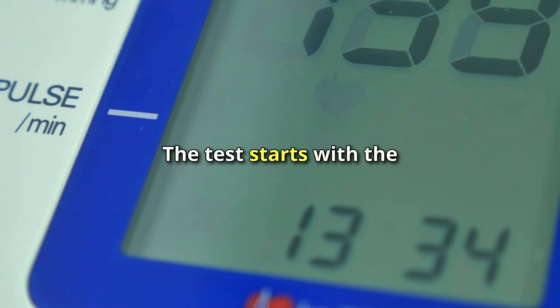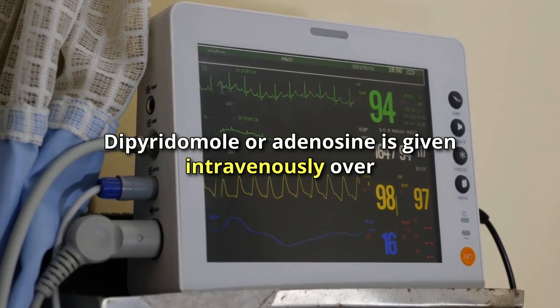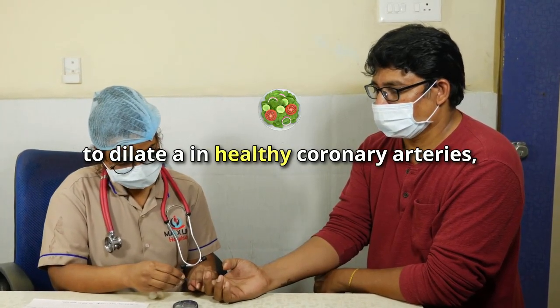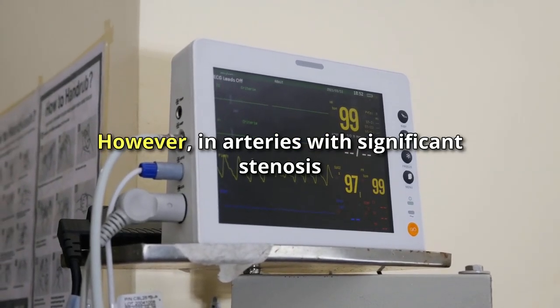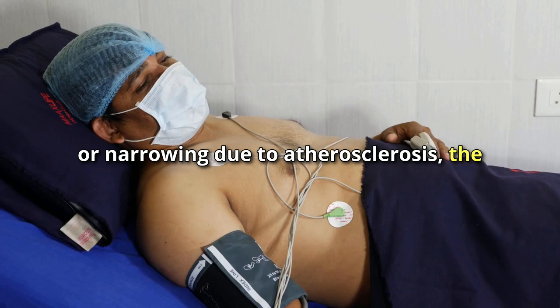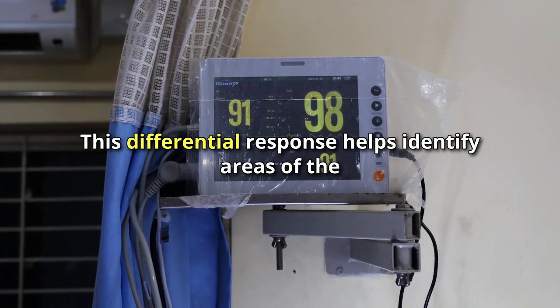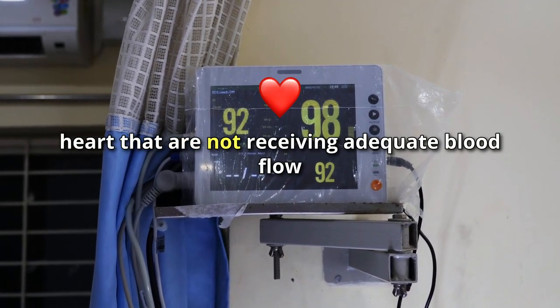The test starts with the administration of the vasodilator. Dipyridamole or adenosine is given intravenously over a few minutes, causing the coronary arteries to dilate. In healthy coronary arteries, this vasodilation significantly increases blood flow. However, in arteries with significant stenosis, or narrowing due to atherosclerosis, the response is limited because these arteries are already maximally dilated at rest. This differential response helps identify areas of the heart that are not receiving adequate blood flow.